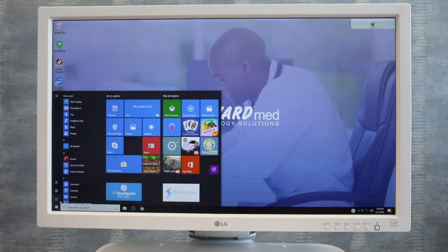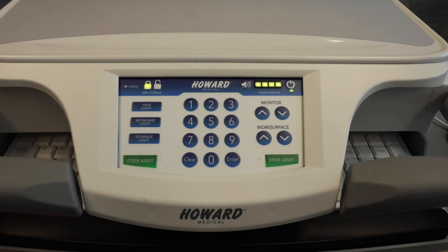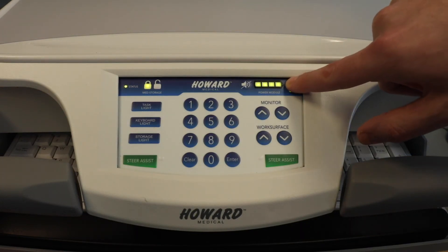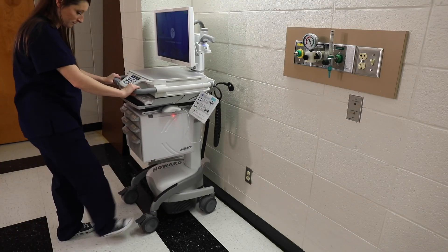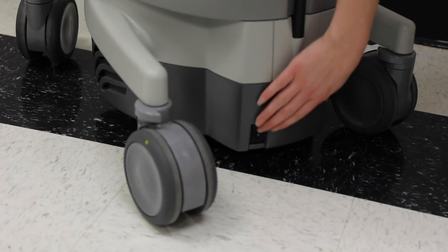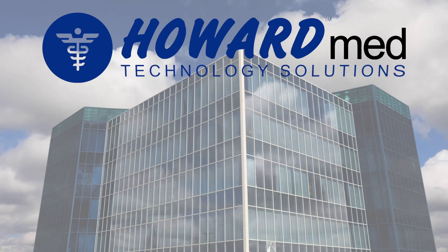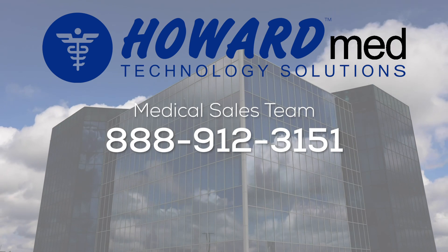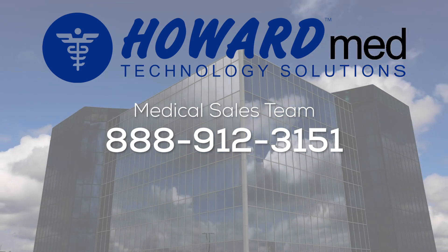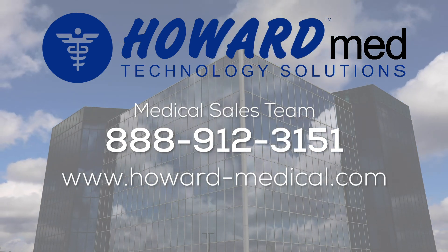To completely power down the cart, first properly shut down the computing device. Press and hold the AC power button located on the top right corner of the keypad, right next to the fuel gauge, until the on button is no longer illuminated. If storing the cart for an extended period of time, DC power can be turned off by flipping the DC switch on the back of the cart. For any additional product information, please contact the Howard Medical Sales Team by phone at 888-912-3151 or through our website at www.howard-medical.com.